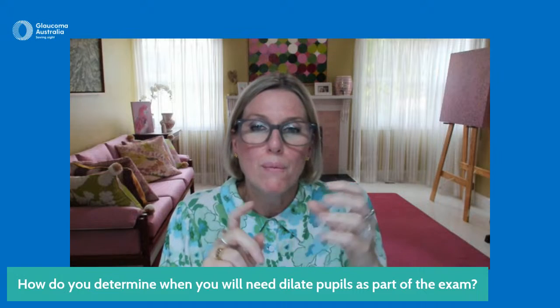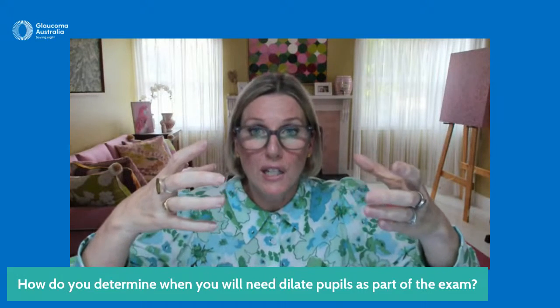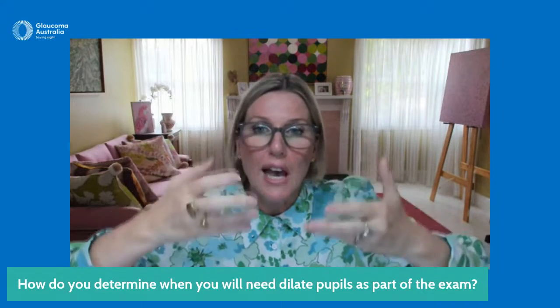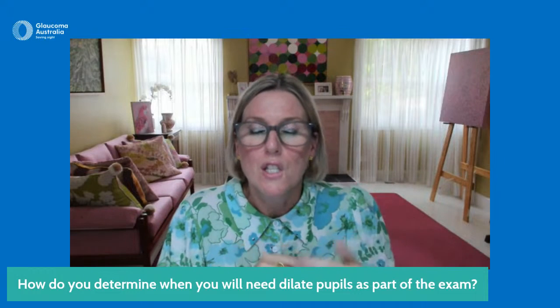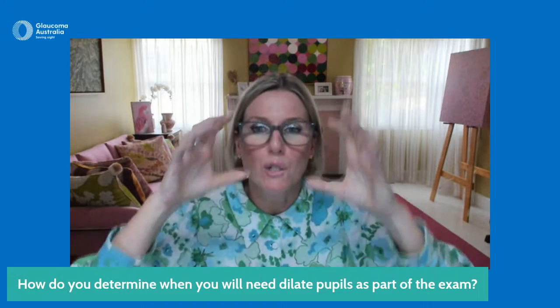And you may remember I mentioned the eye stretching out of shape. That is the eye stretching. If it gets too big, the child becomes short-sighted. If it stretches out of shape, then they can get what we call astigmatism. So we have drops so that we can measure for that, and drops to get those larger pupils.